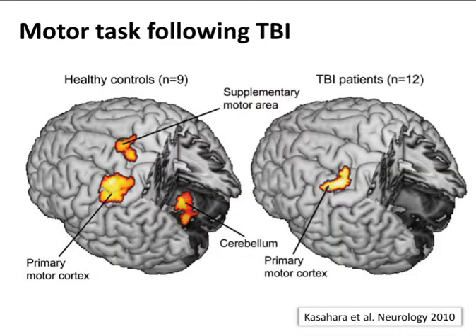And finally, to talk a little bit about functional MRI, I think, to say very briefly, functional MRI is only in its infancy in terms of assessing the sequelae of traumatic brain injury. This is a very interesting recent paper from David Menon and his group looking at the functional activation that occurs with a simple motor task.